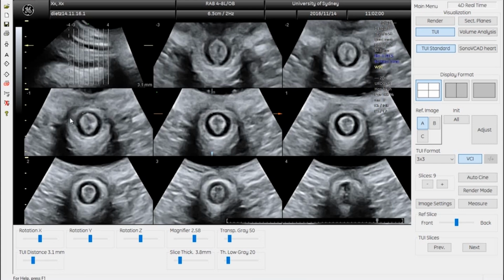There's some irregularity here and there, which is a fairly common artifact, because these parts of the EAS run parallel to the incident beam, which means they won't be quite so echogenic. Just normally, this area and that area will be more echogenic than this and that. And it's most obvious where the sphincter starts to thin a little. The perineum, incidentally, looks pretty much normal, maybe a tiny scar here. So this is a completely normal sphincter.